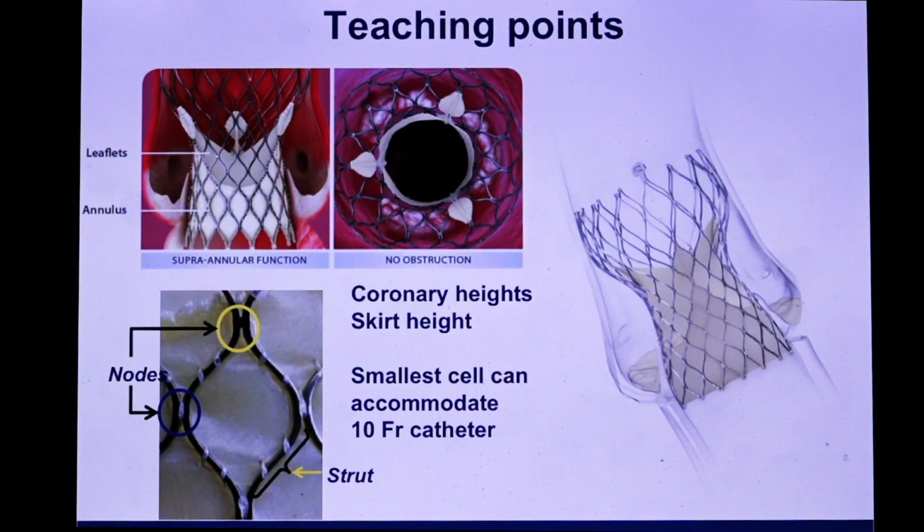And the third important point is Impella position. We usually put the Impella in a way that the outlet is just outside the aortic valve, but with the CoreValve in position, we want to put it a little bit higher. The outlet should be a little bit higher, so we have an outflow actually in the aorta, not interrupting the skirt of the CoreValve. So thank you so much, and happy to answer any questions.